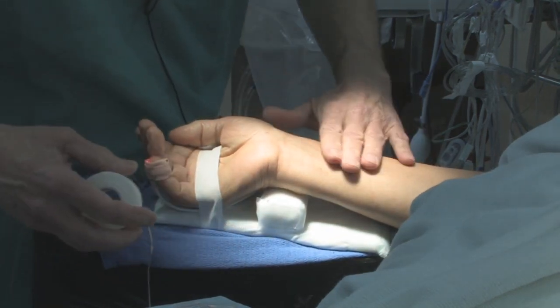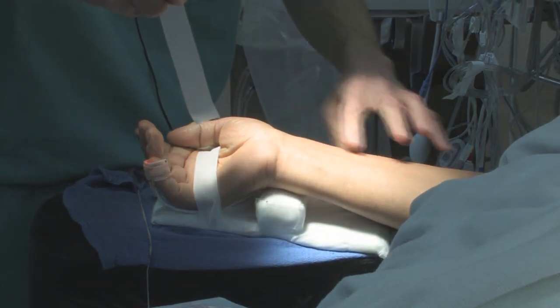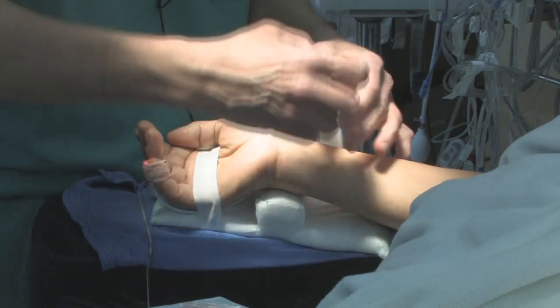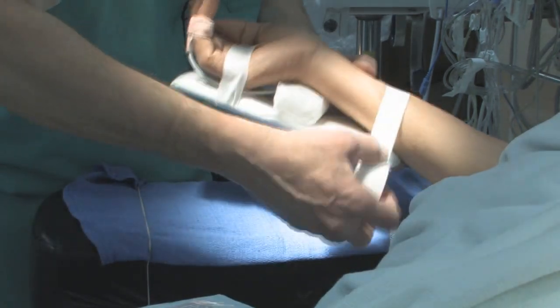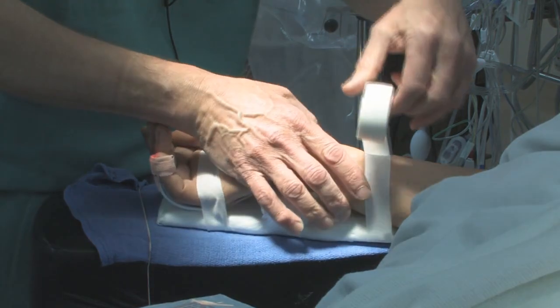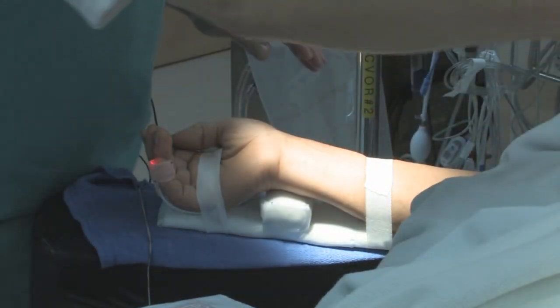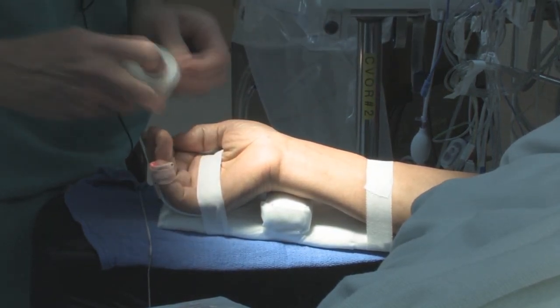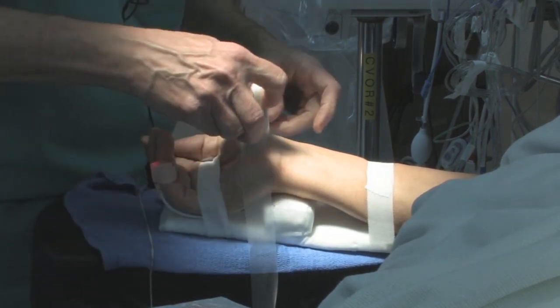I remove any arm band and come right to the end of the armboard. This way, if I get a hematoma and can't get in, it gives me enough space to go back proximally. If the arm is positioned too far in, your field is smaller. I come around, make sure it's not too tight. To keep the hand parallel, I put a piece of tape temporarily across the palm and around the table so the arm stays parallel.